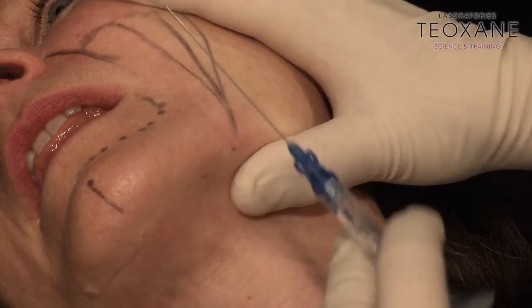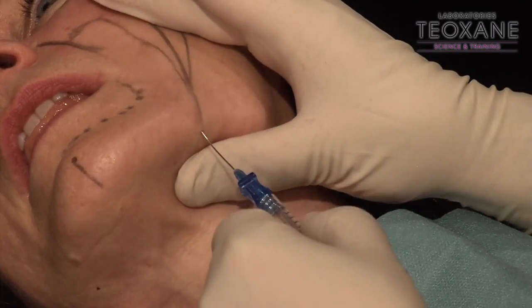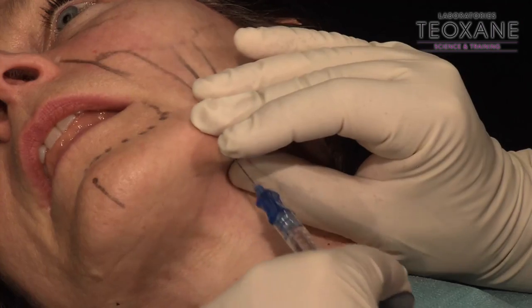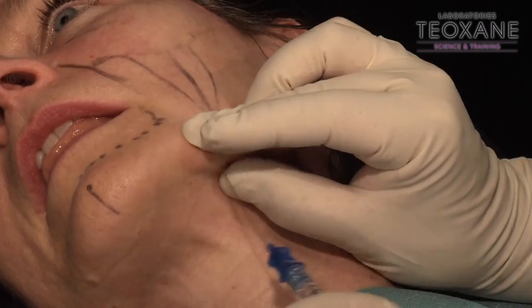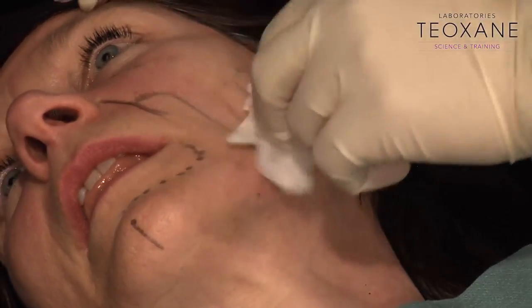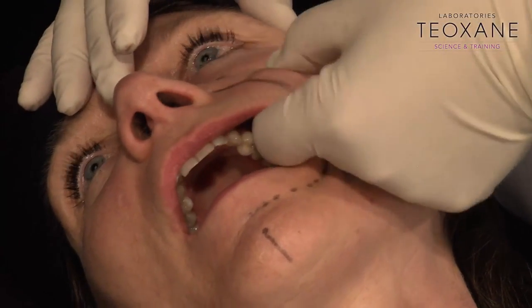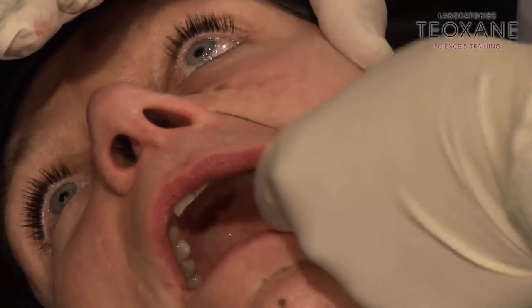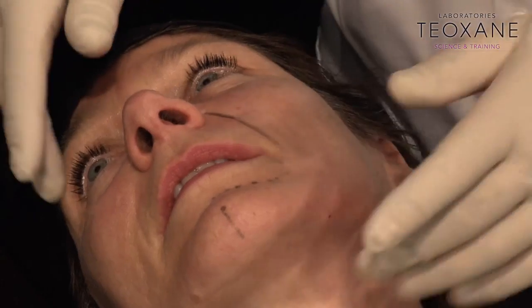Same thing. It's tight. It's all fine. Okay, I want to control what I'm doing. Stay with me. So put my finger inside. Open your mouth, please. I want to check if it's quite even with my fingers. Okay, I spread out. It's quite even, I'm sure. I'm fine. I'm going to feel the chin area.